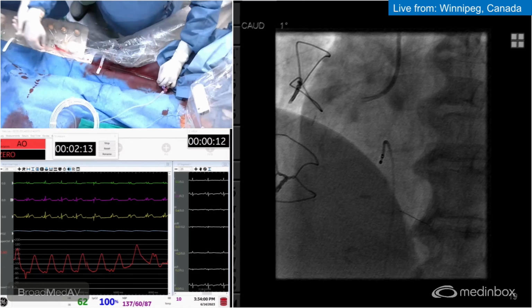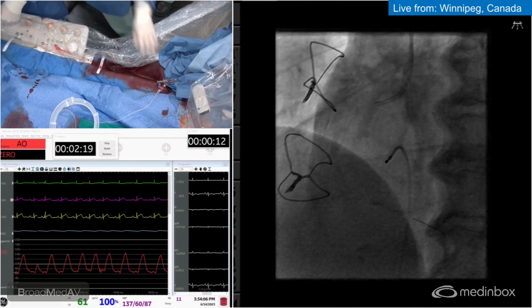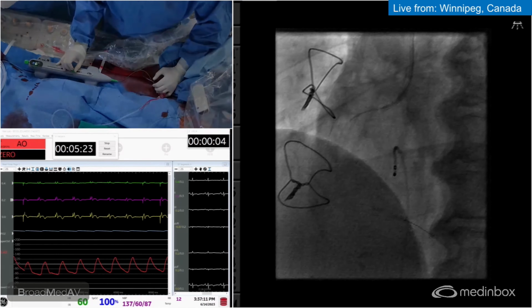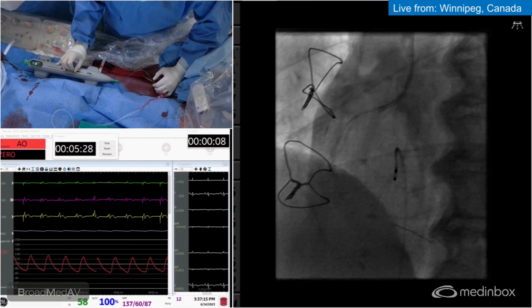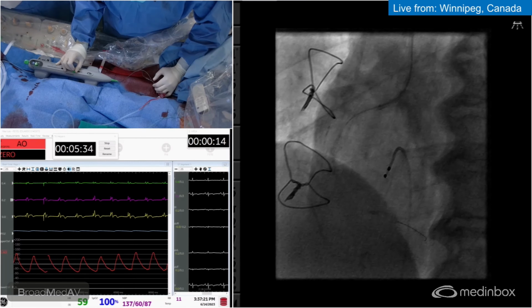Just make sure. I'm just going to explore here. I'm just going to see whether we have any dissections anywhere that we are not going to propagate. No, look. Oh, there's a lot of resistance there. So it tells me that I'm ablating more. So you're ablating now in the proximal lesion, which on OCT showed some degree of a nodular segment. So this should work well.